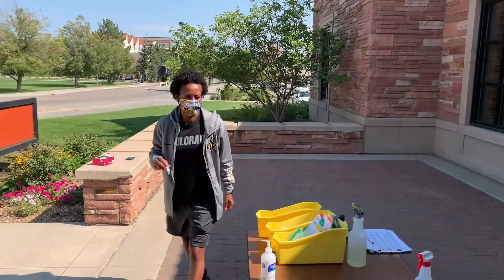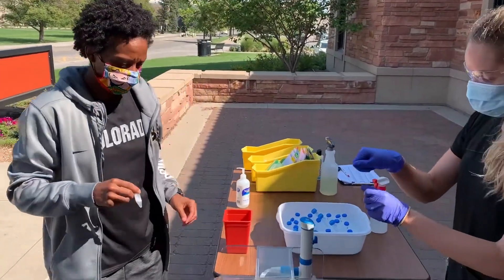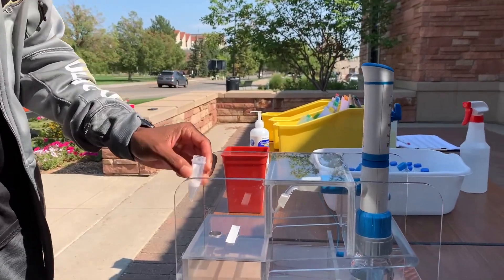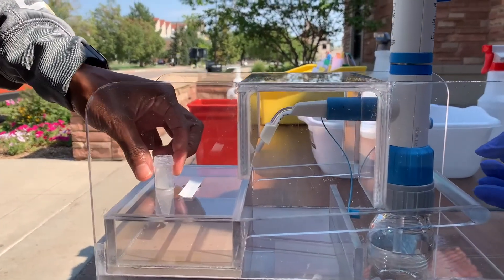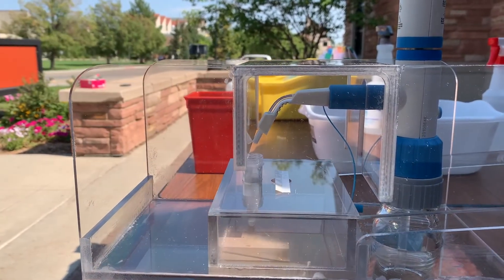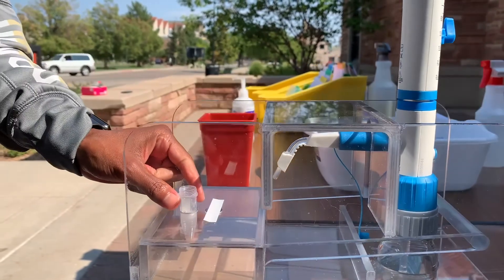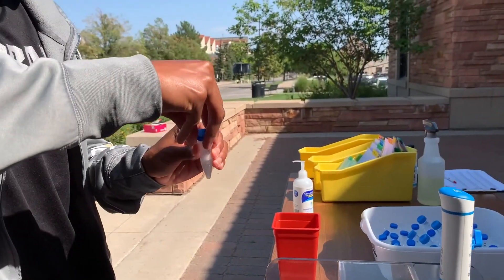When you come back to the table, you will clean your hands and clean the tube. Then uncap the tube and place it in the hole in the collection tray. Our staff will then slide the sample in, add a non-toxic preservative, and slide the sample back to you.